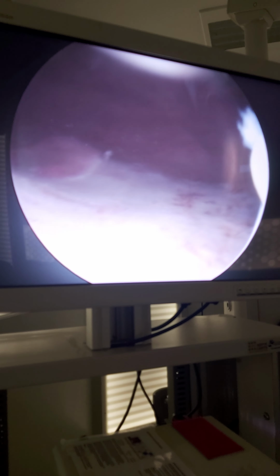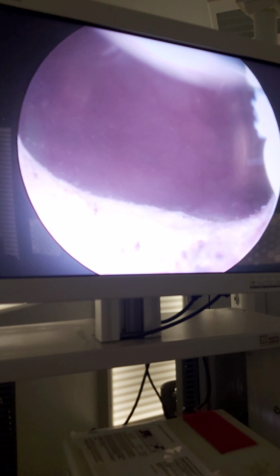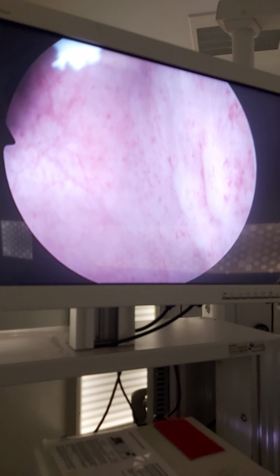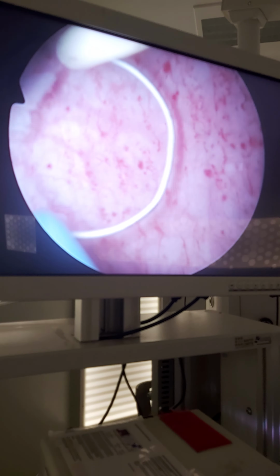Okay, now I've finished. The trigone is okay. There were significant trigonitis and leukoplakia in the bladder neck, and the bladder walls were more fragile than I expected, but it was normal. This lady has had the disease for too long, and as I said, I'm making some spots of fulgurations to these areas, trying to improve the formation of new tissues. So I made a couple of them to these places, and now it's not bleeding. This is a good sign, and her bladder capacity is good. This is also a good sign. Yes, we will wait and see with the healing time.